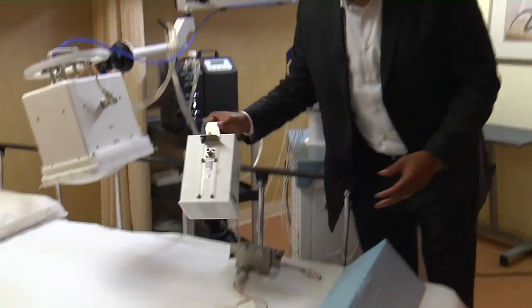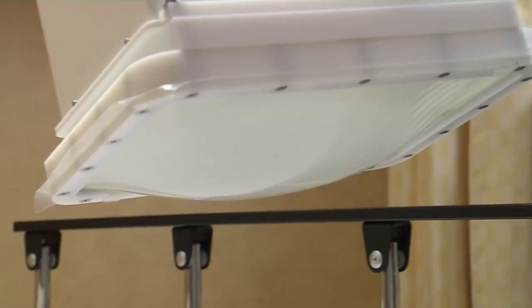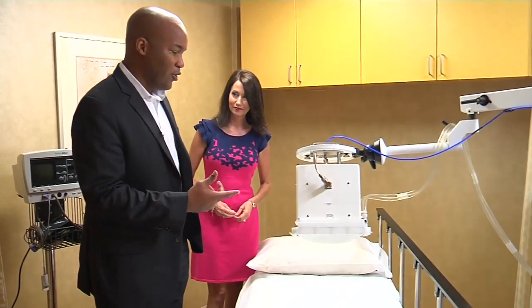Ideally, for this treatment to be successful, we want the temperature to be maintained at about 108 degrees, anywhere from 30 minutes to an hour. And it's usually done in conjunction with radiation. So even though heat can kill cancer cells, when it's given in combination with radiation and even chemotherapy, it's more effective. Heat is delivered by placing a liquid-filled bladder against the skin. Although it's not considered a curative treatment, hyperthermia is successfully turning up the heat on tumors.